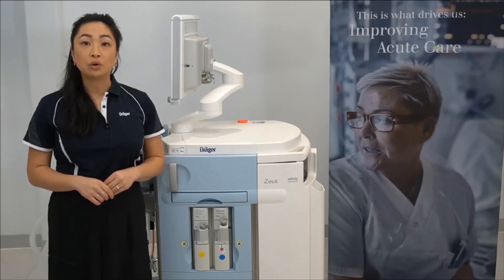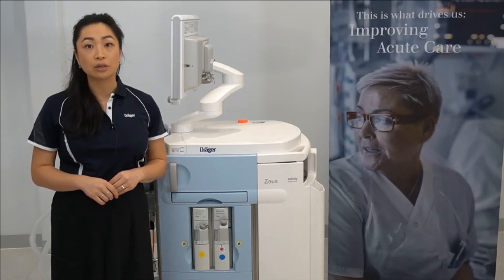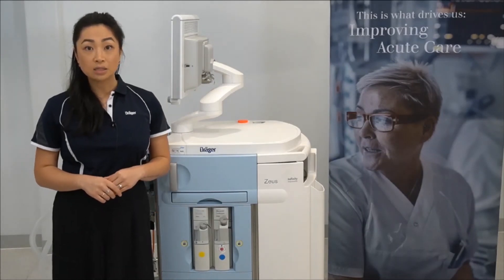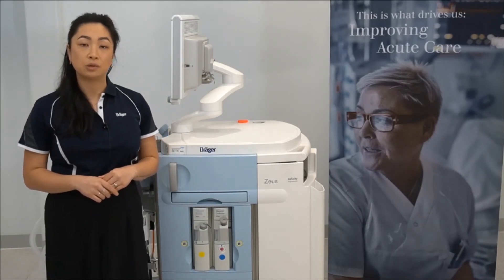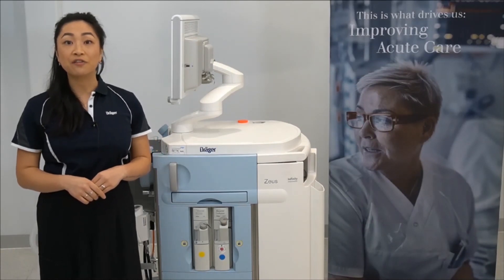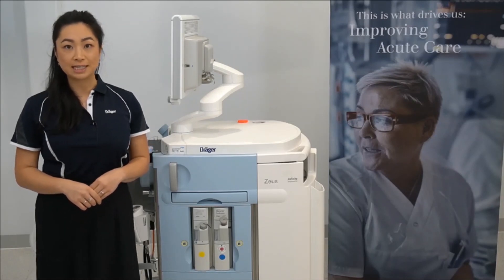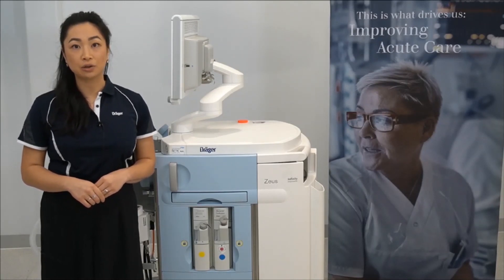Just ensure that you ventilate the reservoir prior to filling, and slowly unscrew the filling caps to allow the slow release of pressure that may have built up during operation. Your device is now ready for the system test. For further information, please refer to the instructions for use or contact your local Dräger representative.